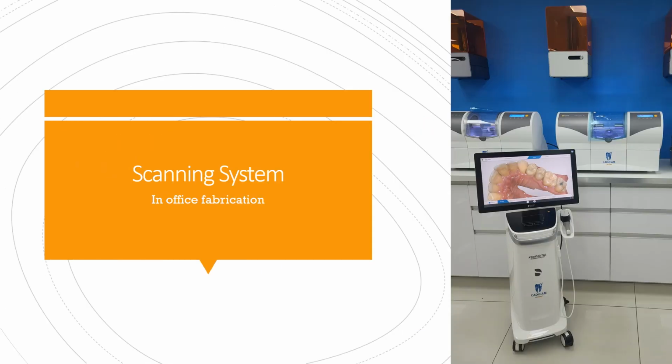There are scanners that use a CAD/CAM system, which allows for in-office fabrication, which means that these patients can have one appointment. In that one appointment, they can come in, have that tooth prepped, and leave with a crown. They don't have to wait the traditional 2 weeks for the turnaround time.